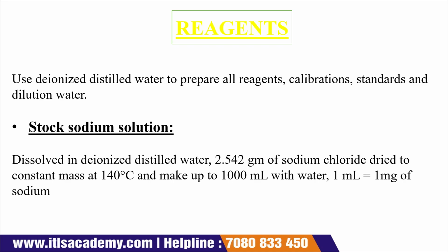So for the preparation of the reagent, first of all, we have to use deionized distilled water. We cannot use only distilled water; in the place of distilled water, we have to use deionized distilled water, and it should be calibrated standard dilution water.